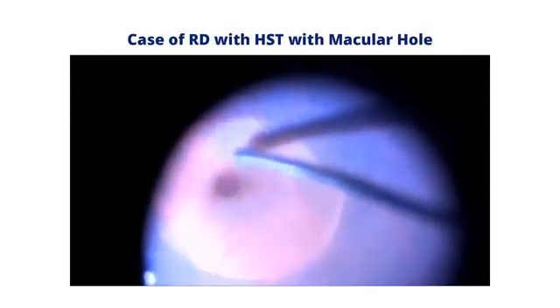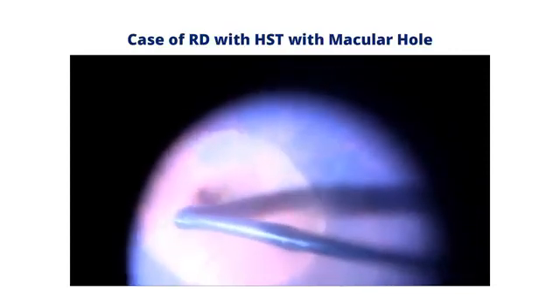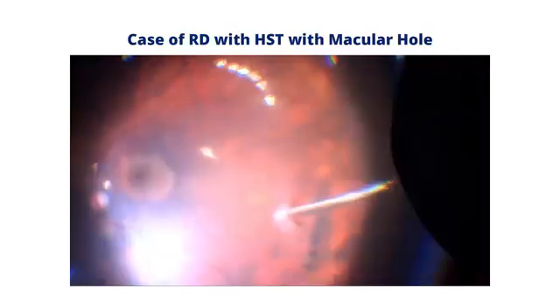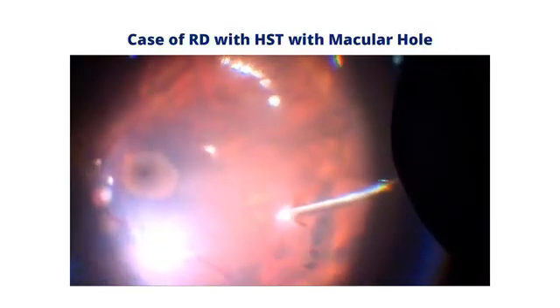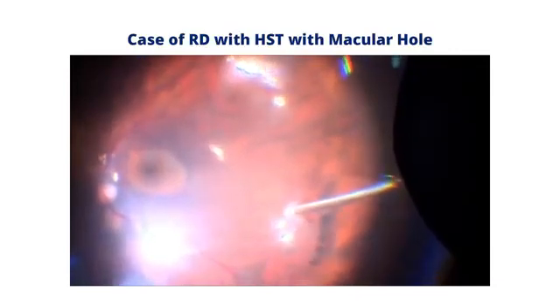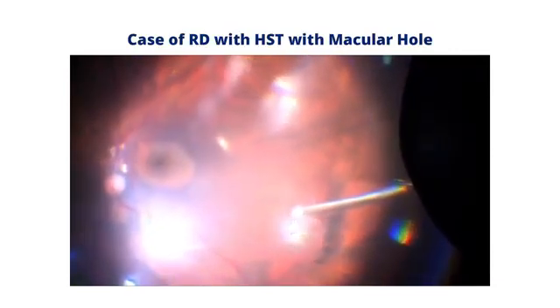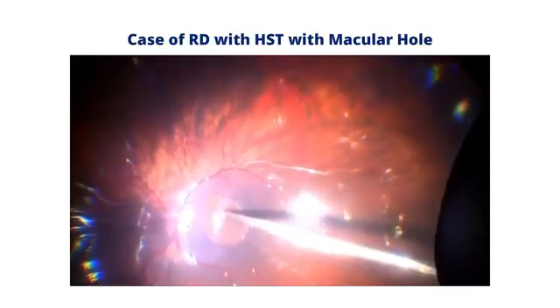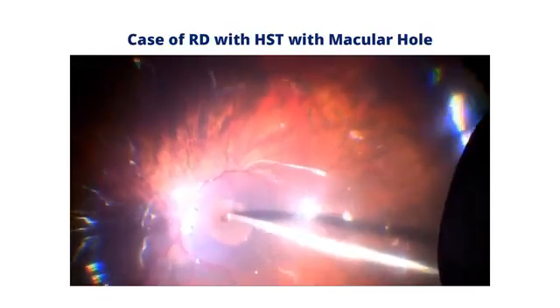So once this maneuver is done, after that air fluid exchange is done and endodrainage is carried out through the horseshoe tear so that the retina flattens. And after that we drain from over the disc and macula so as to approximate the hole. At the end of the surgery, we do laser to the horseshoe tear and the hole shuts.